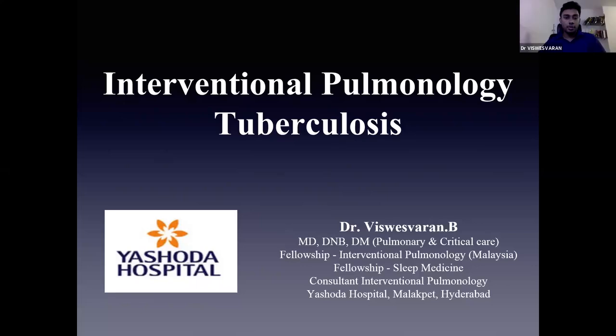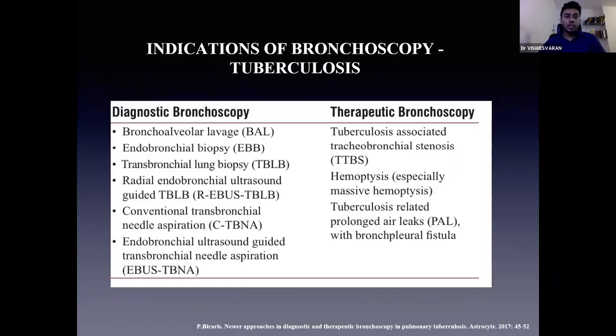Hello friends, today I will be speaking on the role of interventional pulmonology in tuberculosis. The various indications of bronchoscopy in tuberculosis can be broadly classified into those which are used for diagnostic purposes and those which are used for therapeutic purposes.